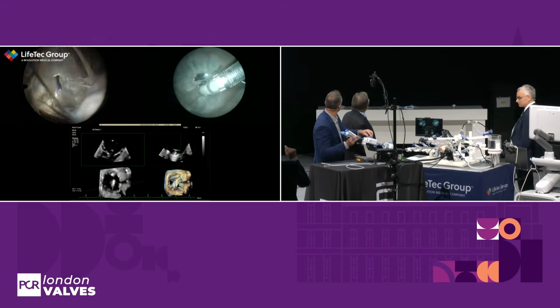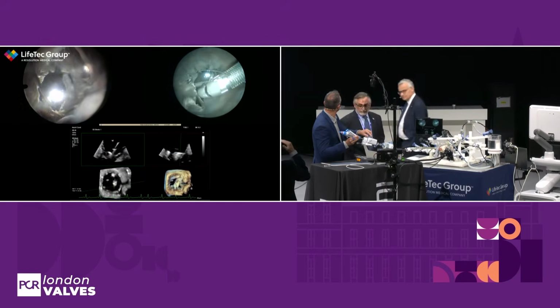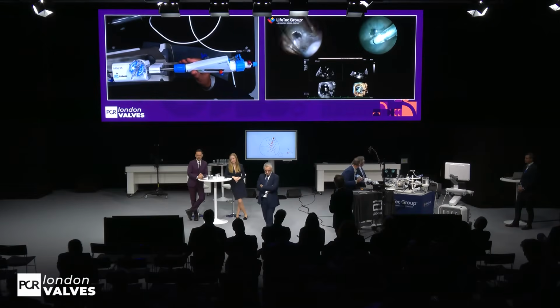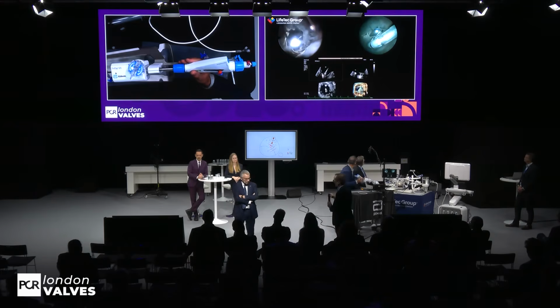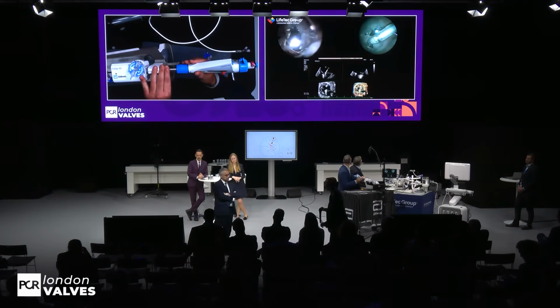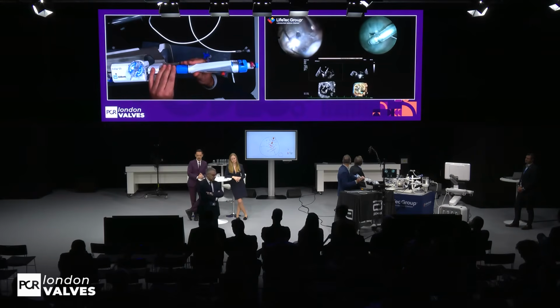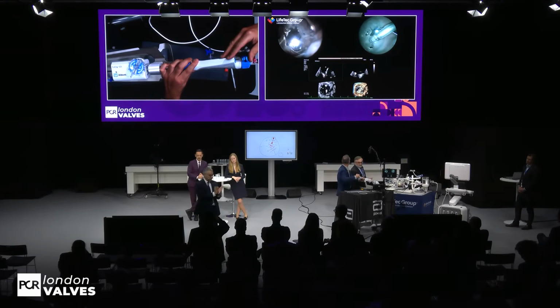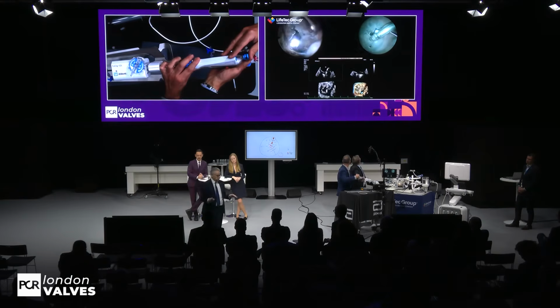I have a question for you. Should we open the clip more, or is it correct to have the clip not completely open? That's a good technical question. In my practice, I always cross open. The reason is that if you cross with the clip closed, you can get entangled between chordae with the clip closed, which is a no-go. So I prefer to cross with open leaflets, also because most of our practice is transgastric view. You need to see, and you see clearly all the time you cross the leaflets. So I go with the open clip.